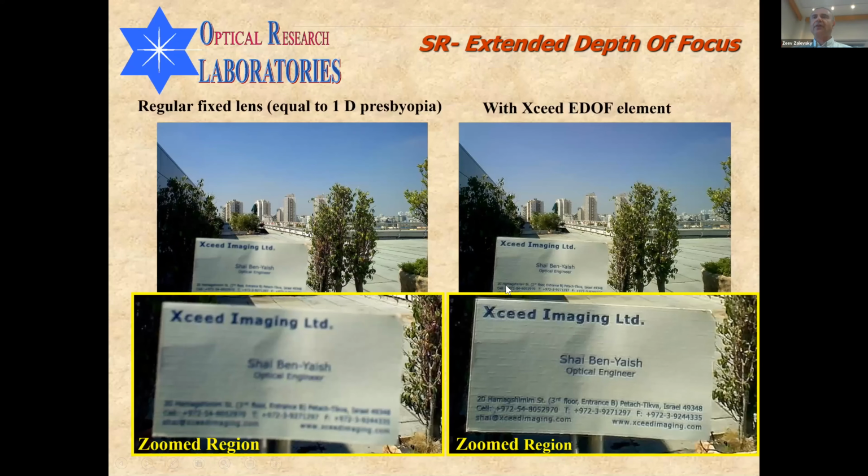Now, whenever we extend the depth of focus and generate this destructive interference, obviously we need to pay with something. The payment is in the contrast at which the different spatial frequencies are seen with our imaging system through our modified lens. But the point is that we are planning to do this extension of depth of focus for ophthalmic applications.